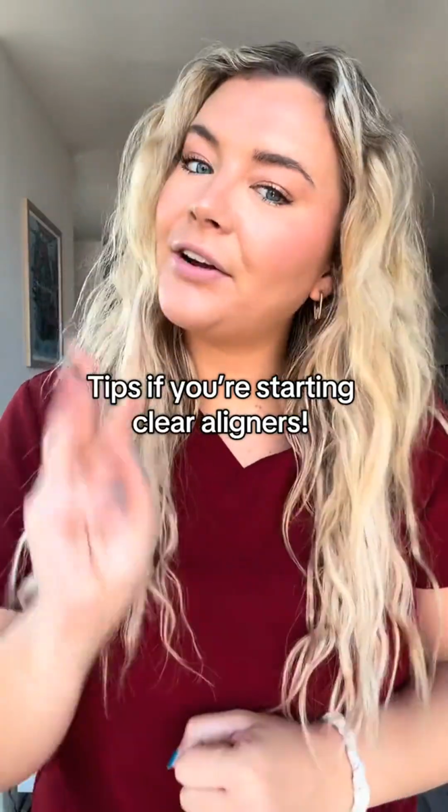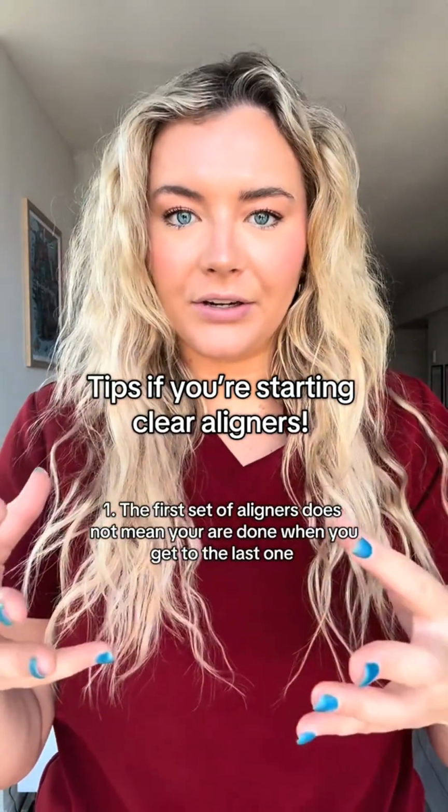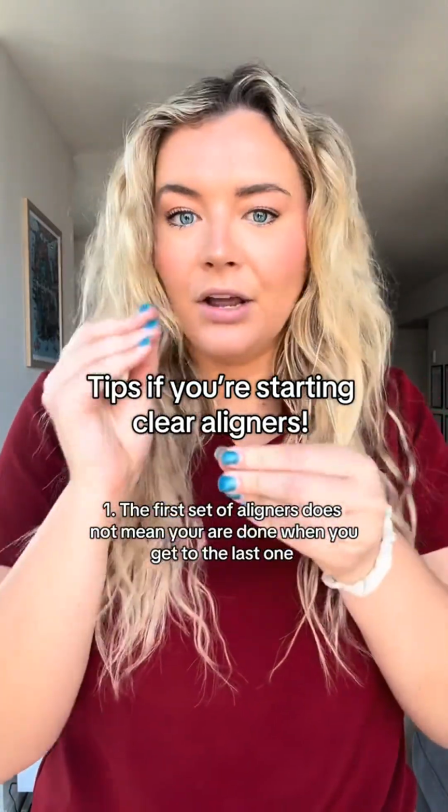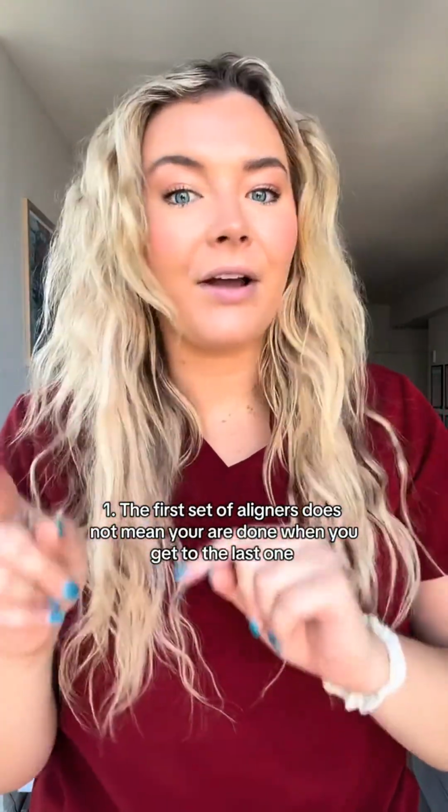If you're starting Invisalign, here are 3 things that you should know. Number 1 is when you get your first round of aligners, let's say you get like a bag that says 1 out of 20.